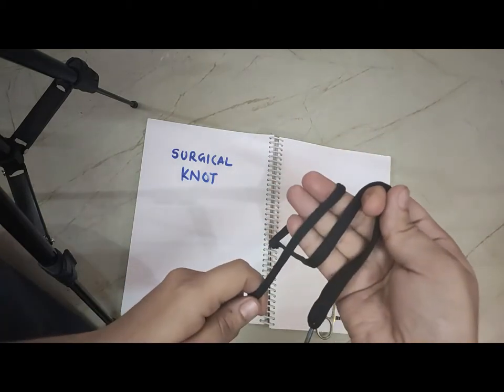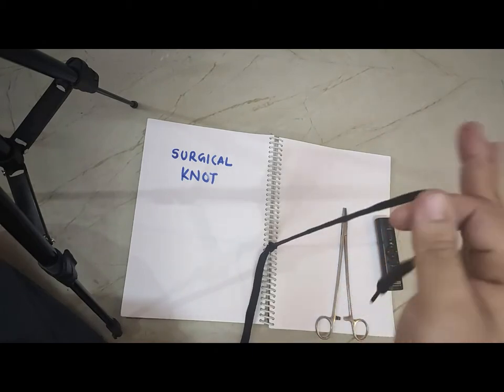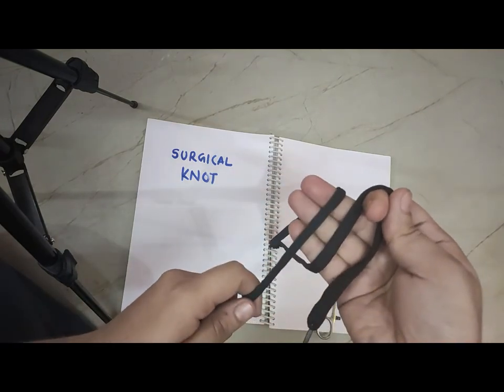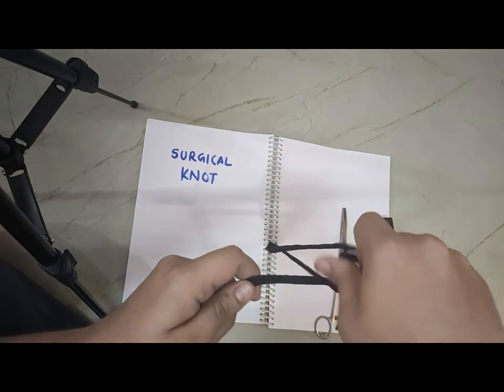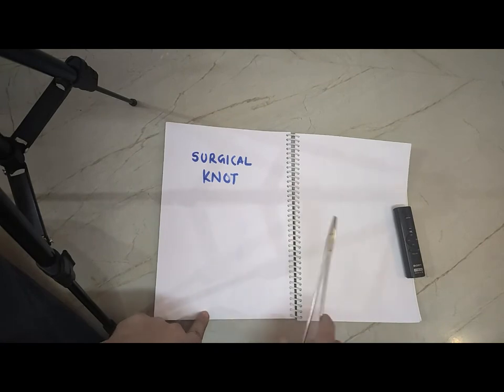Hello everyone. In this video we will do techniques of surgical knot. I will teach you one single technique that is very easy, very quick, and sometimes very attractive.